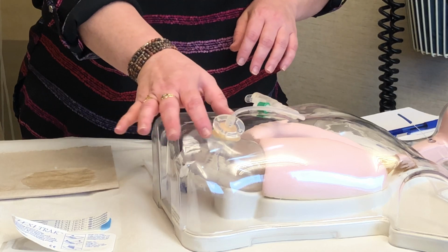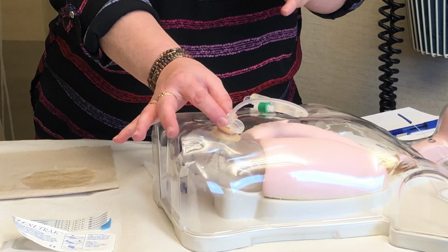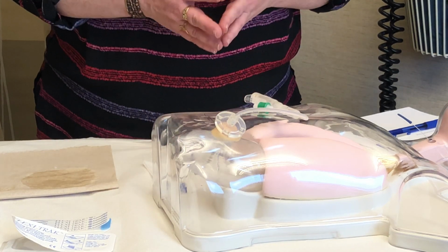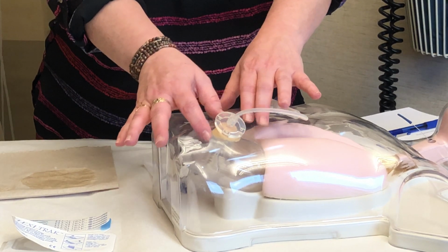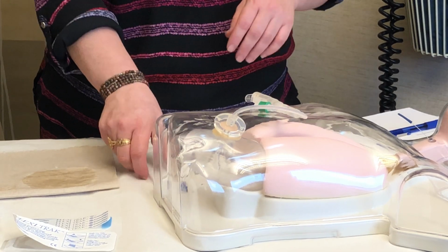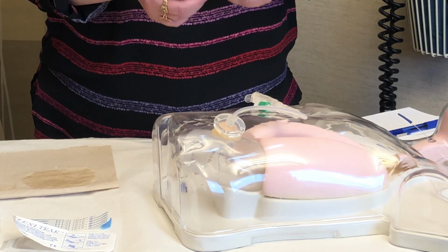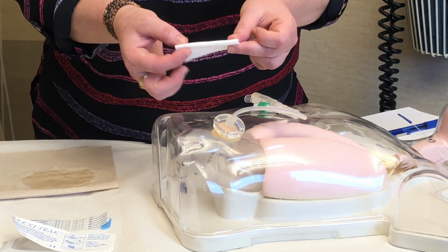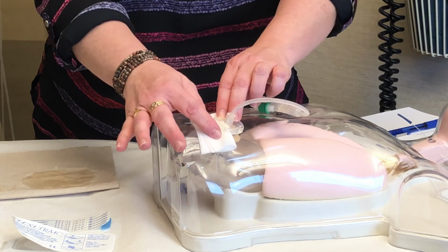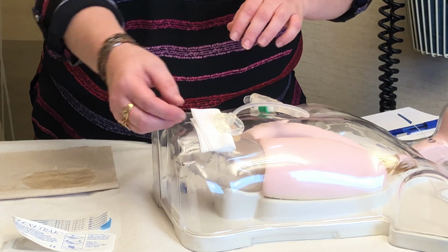The other thing we say with these is do not use any lotions, ointments, or creams underneath the skin disc. It can cause the skin disc to actually slip. We also say no gauze. If it's not leaking, not draining, and everything looks good, we don't want any gauze as a normal thing. If you are having some leakage, and it happens to be getting on your t-shirt, you can take a gauze, fold it in half, and lay it under the lower half of the skin disc. This will help you catch any drainage.